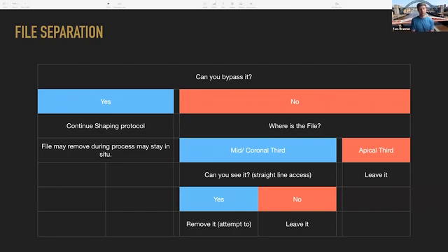But then I'll create my glide path potentially with hand files, and then use something like a reciprocating file. And sometimes it'll bring it out, but sometimes it may stay in place. But if that file's there and you've bypassed it and you've cleaned the apex, then I've no real qualms about leaving it if I think it's going to be too destructive to take it out.